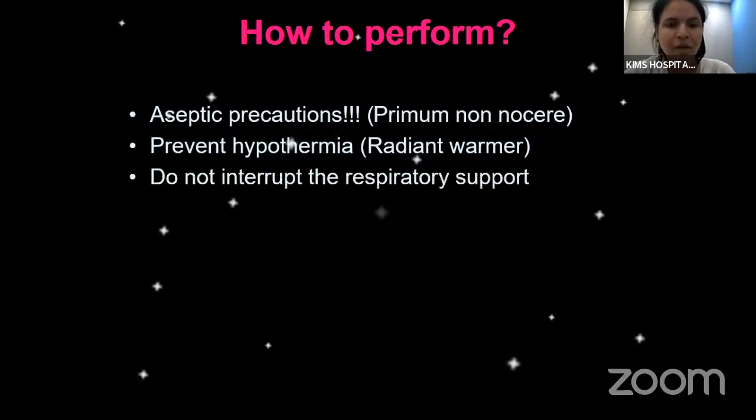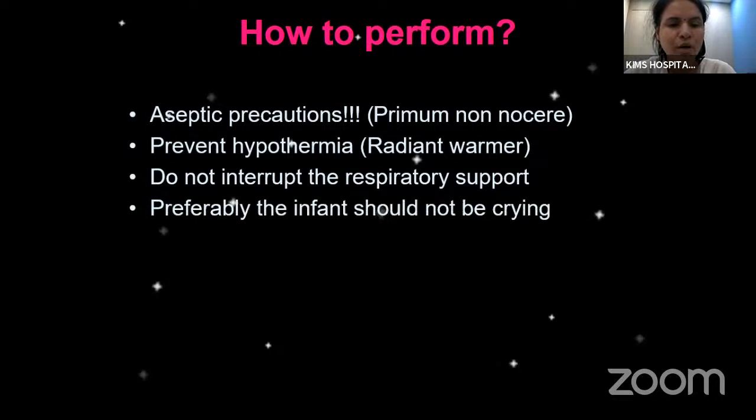Very, very important not to interrupt the respiratory support or hemodynamic support or inotropes while performing the X-ray. So make sure that we do not end up with complications or accidents such as accidental extubation. The newborn safety is of utmost importance. We may sometimes have to remove the ECG leads or temperature probes for the interest of getting a better quality film and to prevent artifacts. But it is very important to ensure that the vital signs, at least the saturation and the heart rate, are being continuously monitored with a pulse oximeter if the baby happens to be a sick baby who is on respiratory support.